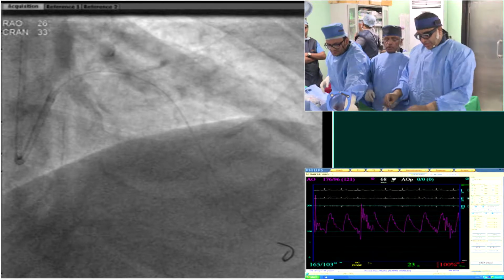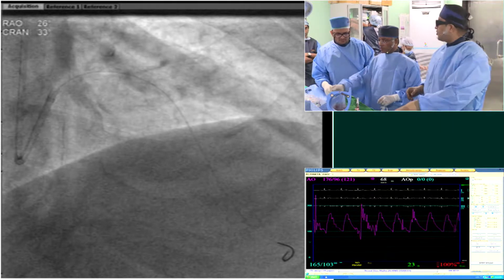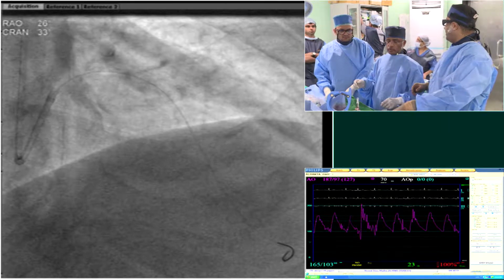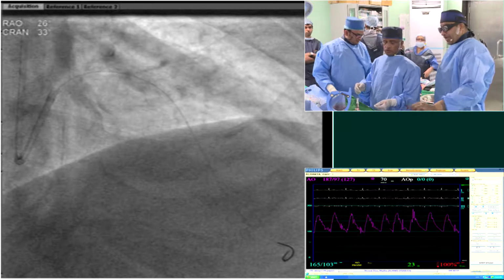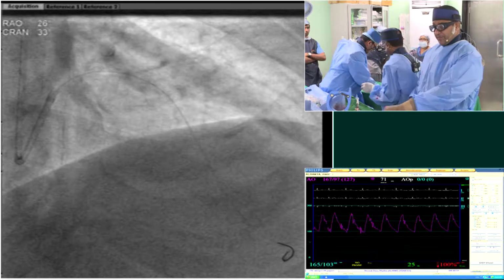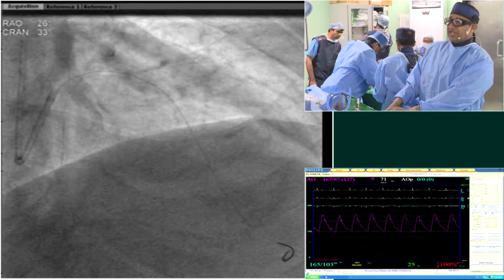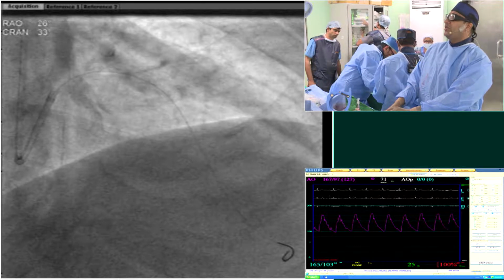And I feel it is the calcium spur and the wire bias that is preventing the OCT catheter from going there. So maybe just changing the wire would help, or a buddy wire next to it. Give the Run Through one more. Run Through then. What is your suggestion? Or should we do a Flextome Trio over there?